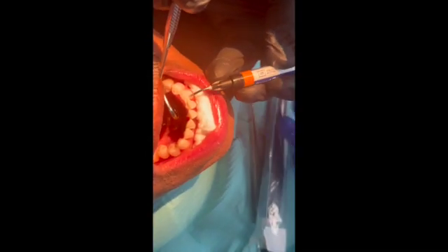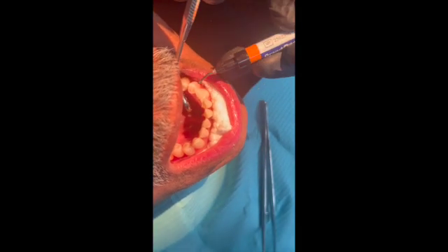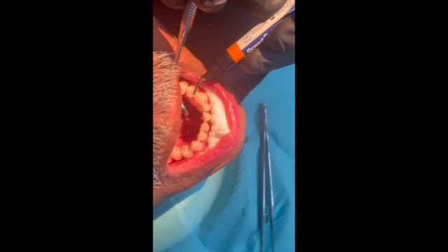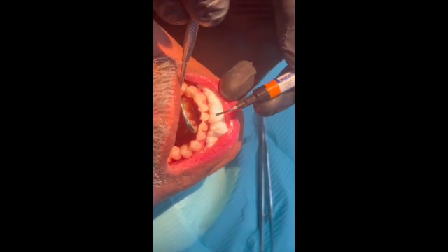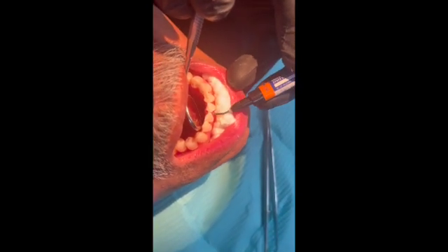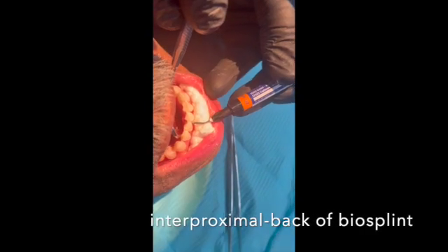I'm just going to put a little bit of composite on the back of these exposed areas where he's got spaces between the teeth.